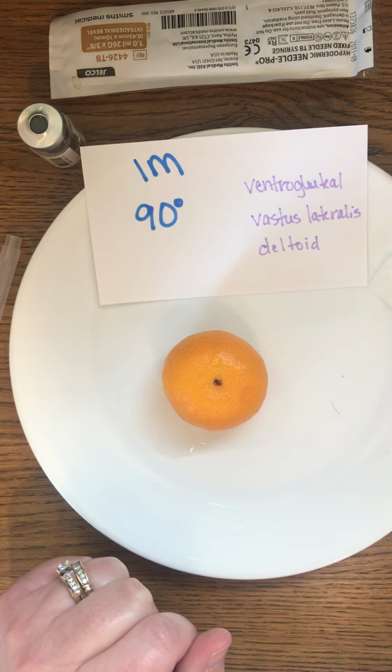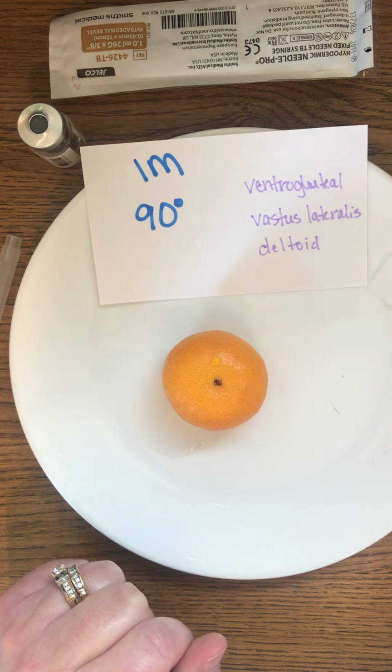It's because we can deliver larger volumes into the intramuscular, so the gauge of the needles is usually bigger. And the angle we are going to go in at is 90 degrees, because we want to get through the skin, through the subcutaneous layer, and into the muscular layer.